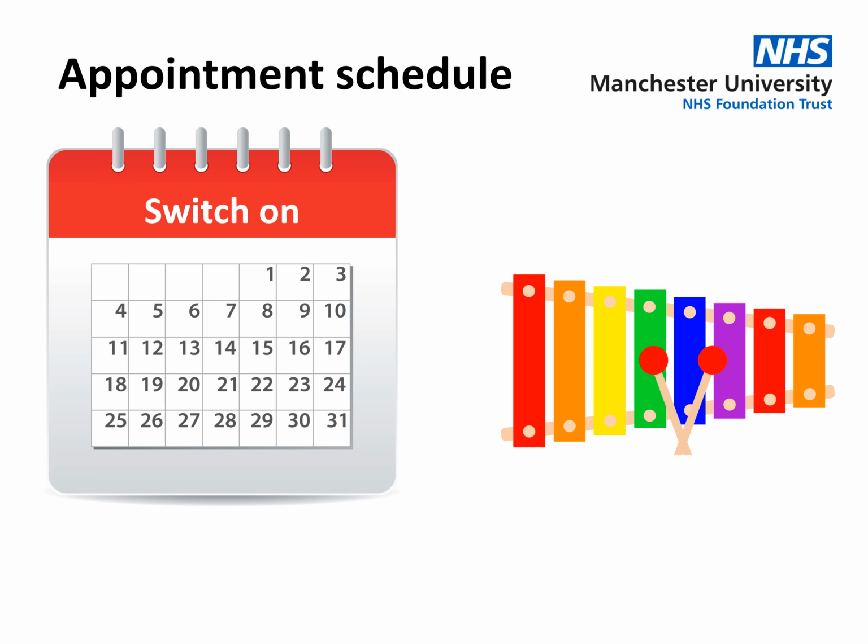This appointment usually holds a lot of expectation for each patient, but the experience can be different for everyone. Before we switch the cochlear implant on, we need to set it up by playing some beeping sounds. You will be asked to tell us when you hear the beeps and how loud they are. Once these different levels are found, the cochlear implant is switched on. At this moment, you will hear sound around you, which may be very strange and very different to hearing you have had before.